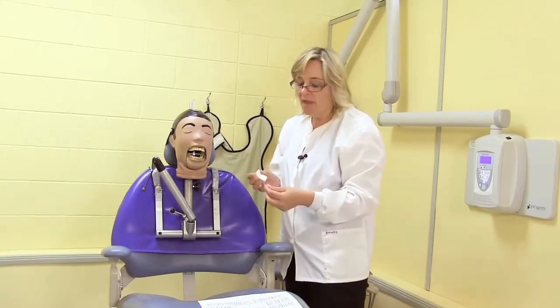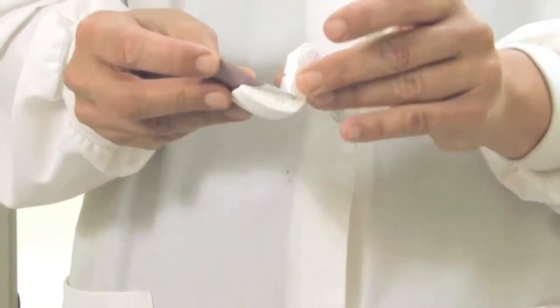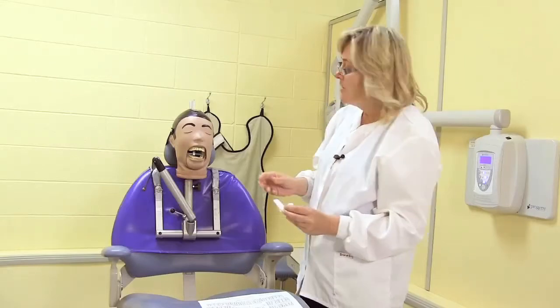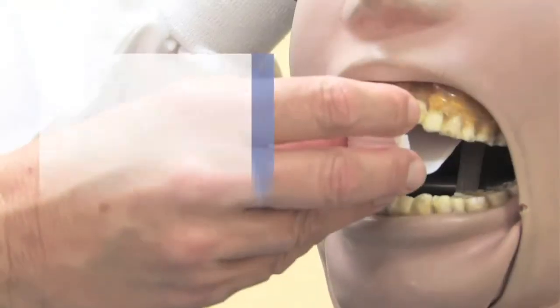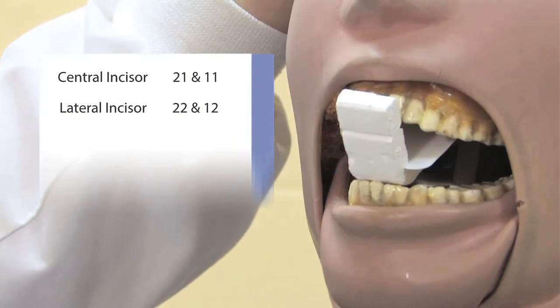So, the placement of the film, size 2 film: always make sure the white side is your exposure side. I feel for the embossed dot on the film, and place it in the stabe bite block. My first shot, coming from the anterior, would be the maxillary anterior teeth: the central incisors, both 2-1 and 1-1, and the lateral incisors, both 2-2 and 1-2.